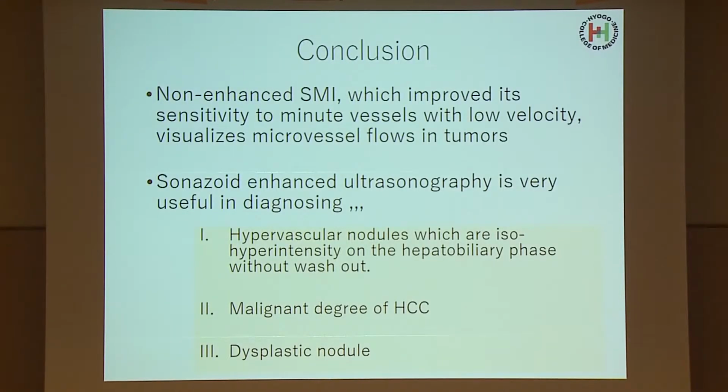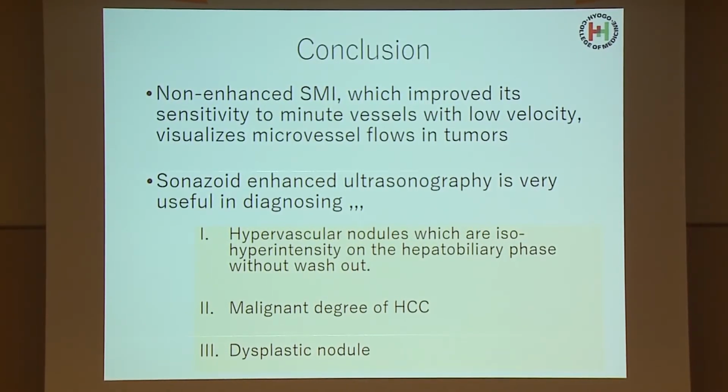In conclusion, non-enhanced SMI, which improved its sensitivity to minute vessels with low velocity, visualizes micro-vessel flow in tumors. Sonazoid-enhanced ultrasonography is very useful in diagnosing hypervascular nodules which are hyperintense on the hepatobiliary phase without washout, malignant degree of HCC, and dysplastic nodule. Thank you very much for your attention. I would like to close this presentation.